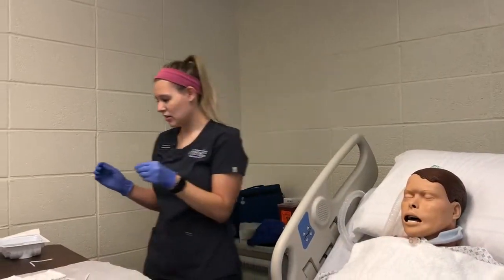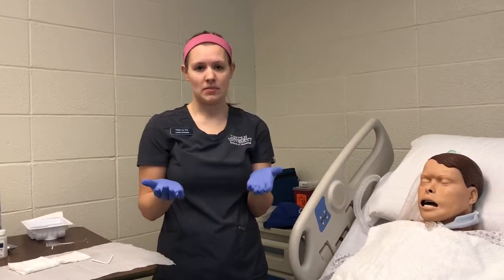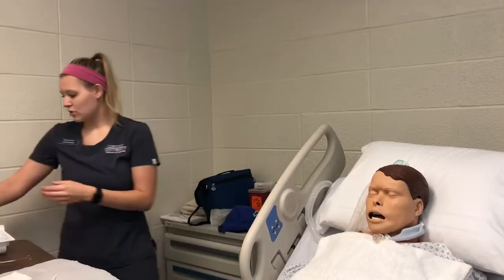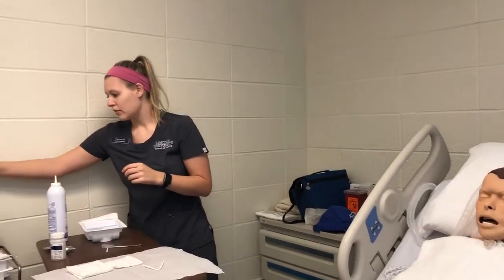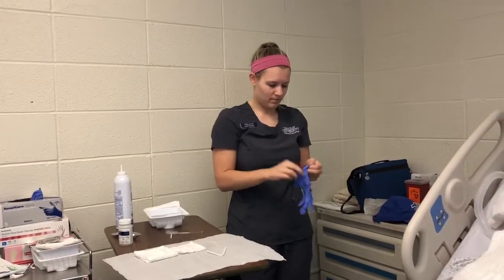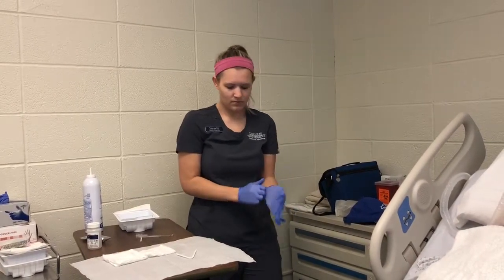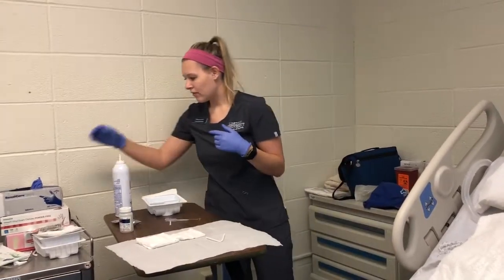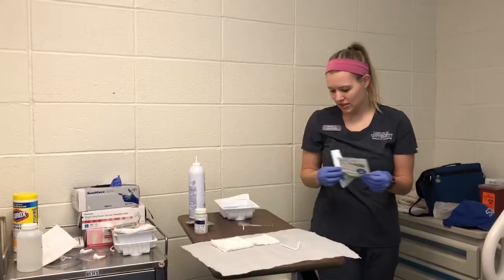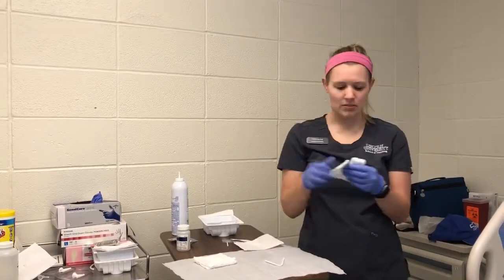And now that that's good, I can put this here. And at this point, whenever I'm changing the gauze and the trach ties, I don't need to be sterile anymore. So I can just take off these sterile gloves, wash my hands, put on a pair of clean gloves. So now I will have a package of these drain sponges on my table, and they are just the sponges, which there aren't any in here, so this is not sterile anymore because I'm not using it anymore. I'll just use these for the simulation.